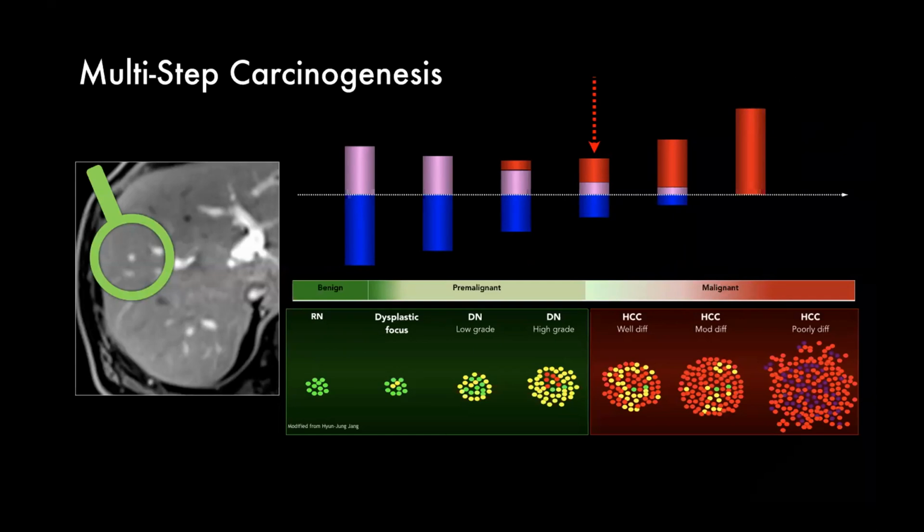And therefore, what you see is a change from a portal venous dominant vascularity to a dominant arterialization of that observation and the adjacent parenchyma. This change in vascularity mirrors the change in the cellular pattern, or the changes in the microscopic milieu of these observations, where you get a grade of dysplasia and then a potential HCC developing. So that means normal liver has a high portal venous supply and a lower arterial component, but as the grade of the observation moves upwards, the arterialization component increases.